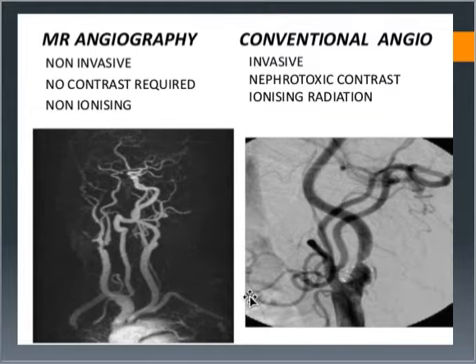And then you've got conventional angiography, which is invasive. They've got to make a little incision in your wrist or your groin. They do use contrast. They call it nephrotoxic contrast on this one because it can be toxic to the kidneys. And again, they're using ionizing radiation, which can be harmful.